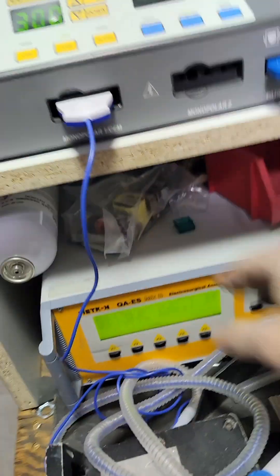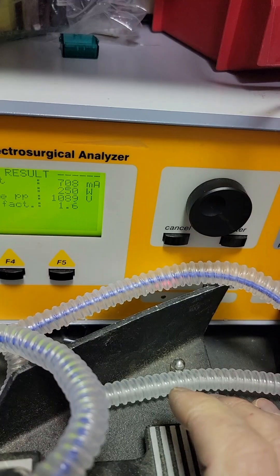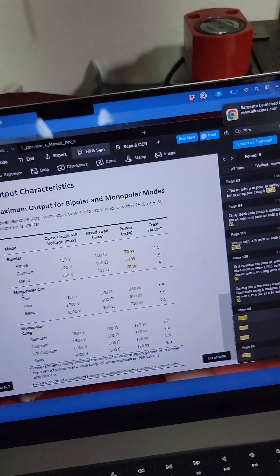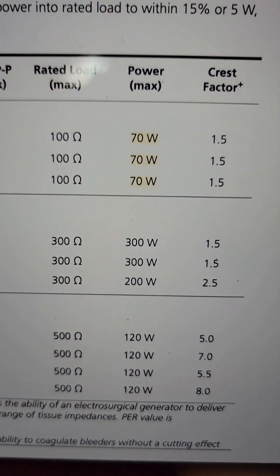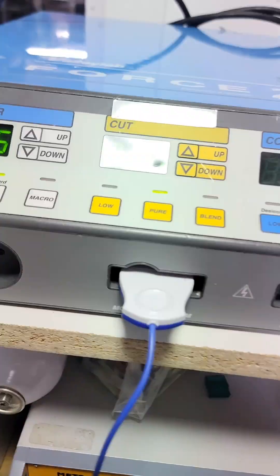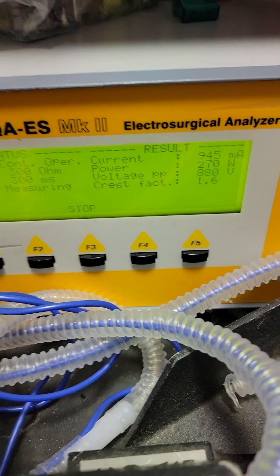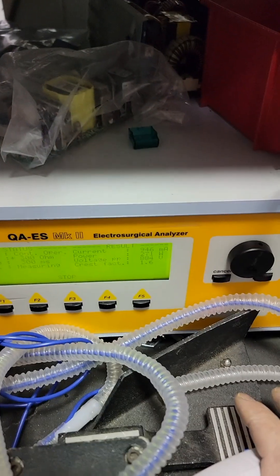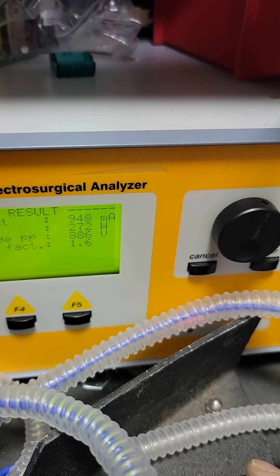Monopolar cut output is 250 watts. But if I double-check the manual, the monopolar cut load is actually 300 ohms, not 500 — and that changes things. Because now with a 300 ohm load, our output at 300 watts reads 270, which is within spec: 15% of 300 would be 45 watts, and we're only about 30 watts away from that, so we're within spec.